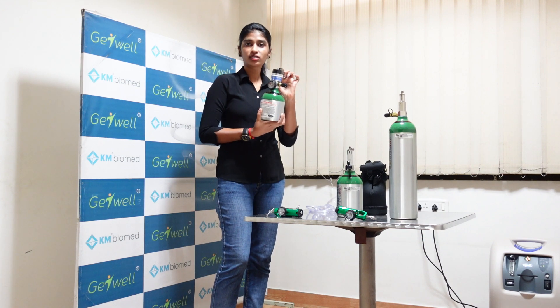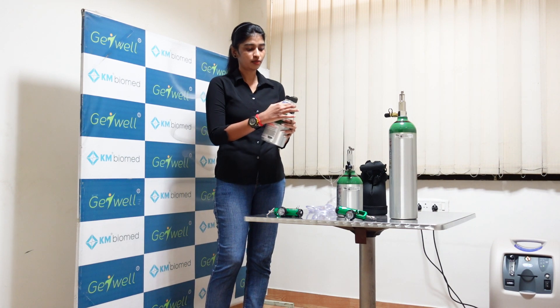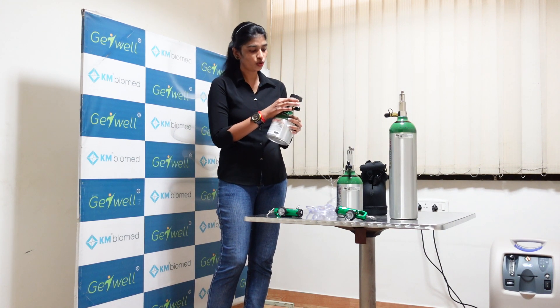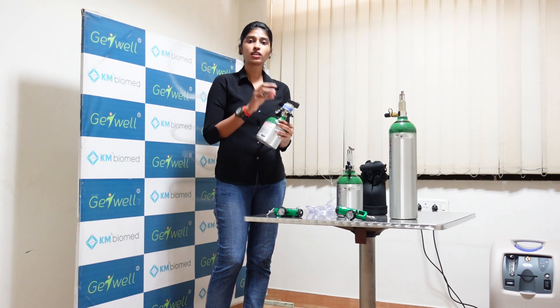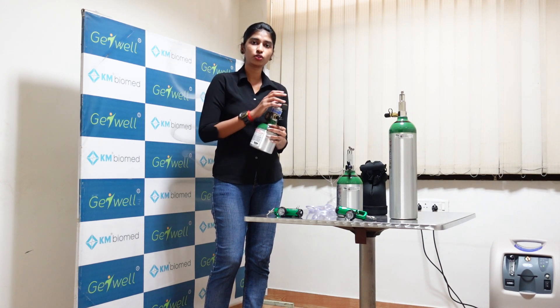I will explain the conserver part. Basically this is designed to prevent oxygen wastage. When you set the flow rate — you can see there will be a triangle — the flow rates go from 1, 2, 3, 4, up to 5. For example, if you are keeping it at 2 litres per minute, it will give you a pulsed kind of oxygen. Whenever the patient is inhaling, it will sense and give the oxygen.